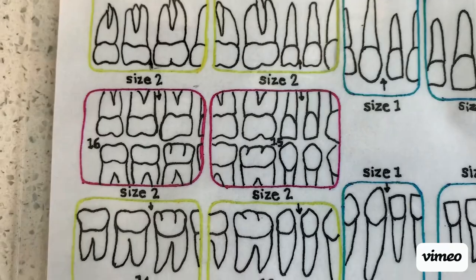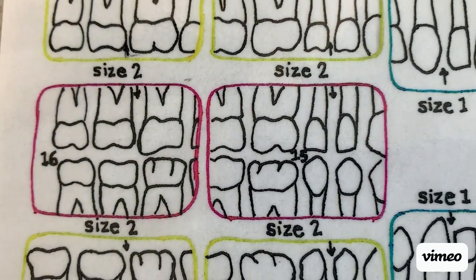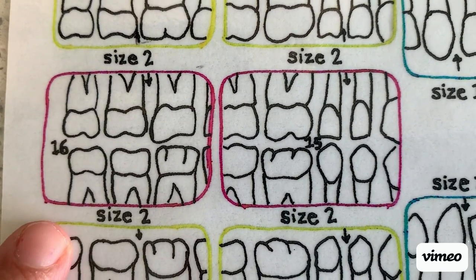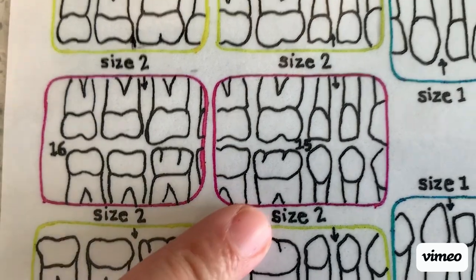This video is going to show you how to take bite wings. We're going to show you both horizontal bite wings and vertical bite wings. We'll start with horizontal, but let's look at your template first. You're going to see that you have four bite wing projections — two on each side, a molar and a premolar.